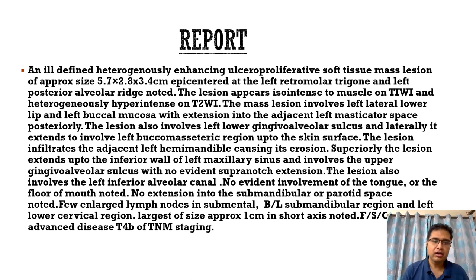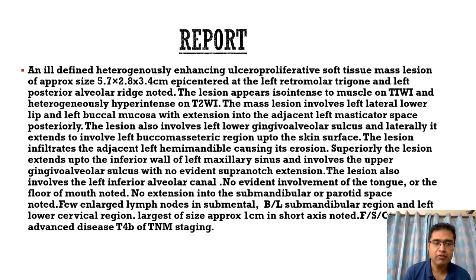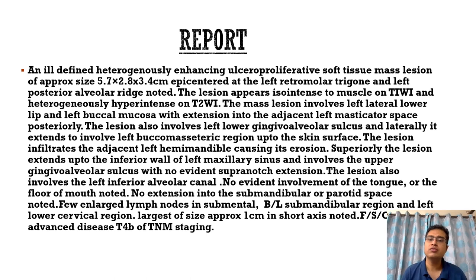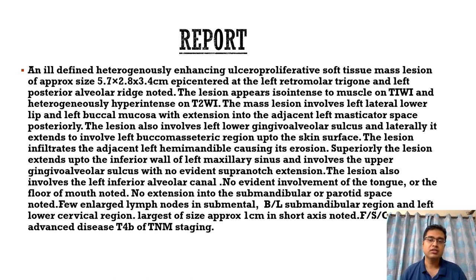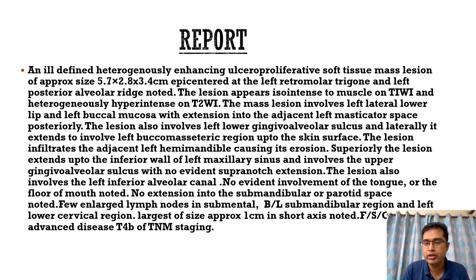All the spaces of the neck are very important and should be remembered thoroughly to determine the extent of the mass lesion. All spaces of the neck are to be assessed in any case of oral carcinoma. The lesion also involves the left lower gingivoalveolar sulcus and laterally extends to involve the left buccal masseteric region up to the skin surface. It is very important to mention whether the mass extends to or involves the skin surface, and how much skin is involved — this gives the treating surgeon an idea of how much graft will be required during surgery.